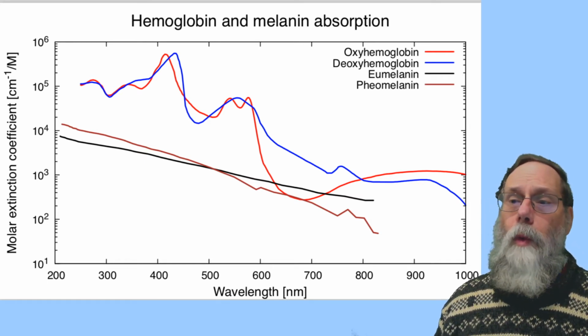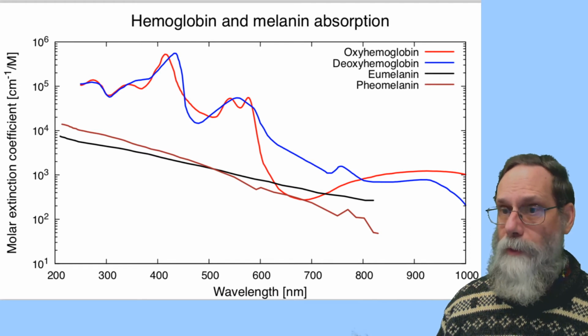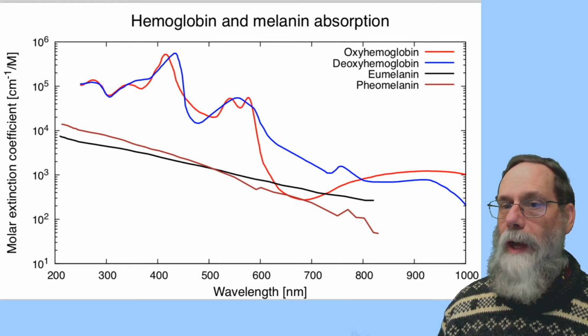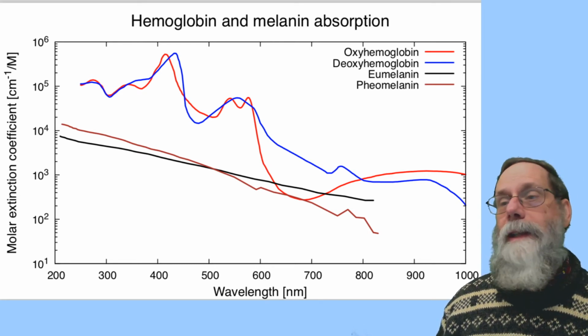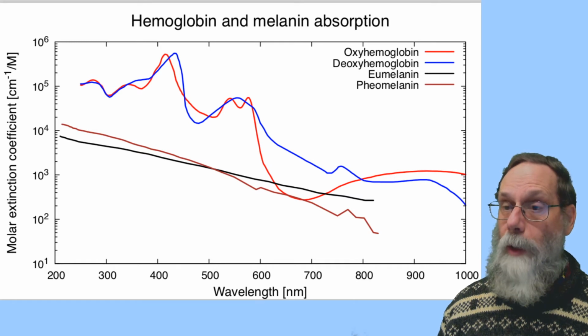So what pulse oximeters do is that they have two different LEDs in them, usually one photocell, and they sort of alternately light up one LED or the other one. And they usually use two different wavelengths, as I mentioned, something around 940 perhaps, and something around 680 perhaps. Then they're alternately lighting these things up and measuring how much light is getting through. So they're measuring the absorption at those two wavelengths.